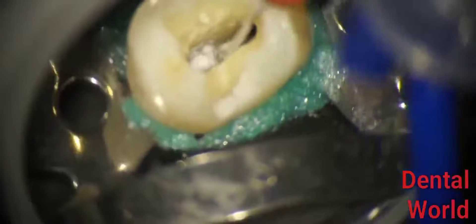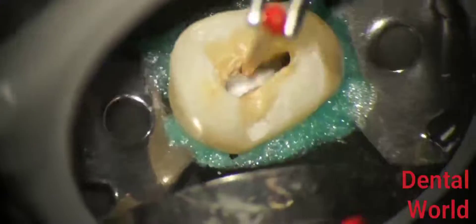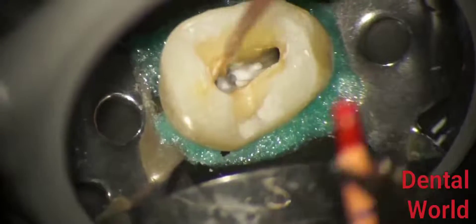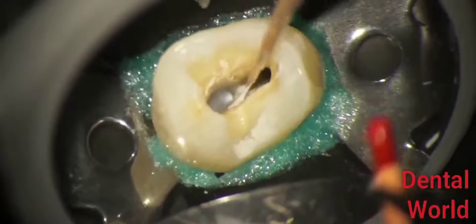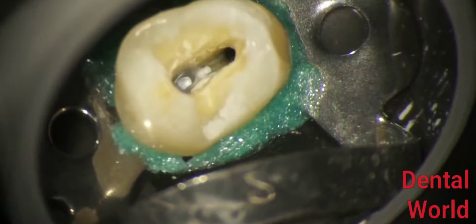Once we're sure the canal is filled, I like to take the master cone into the canal up to working length. We put the master cone all the way to working length, and this ensures the calcium hydroxide is carried all the way right up to the apex. If you zoom in, you can see how the calcium hydroxide has gone right to the apex.